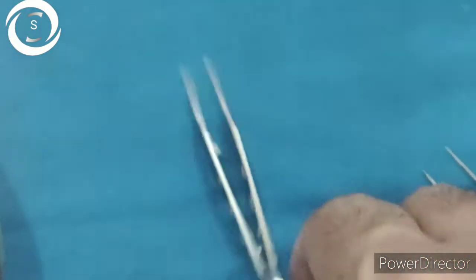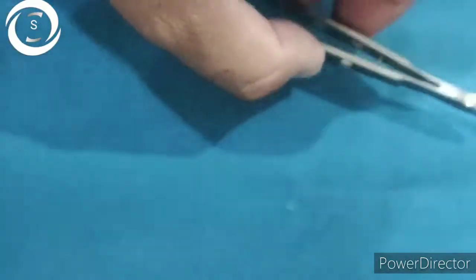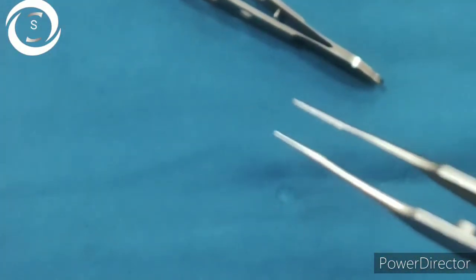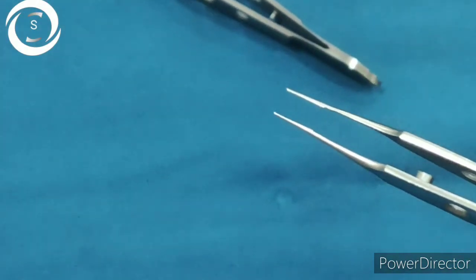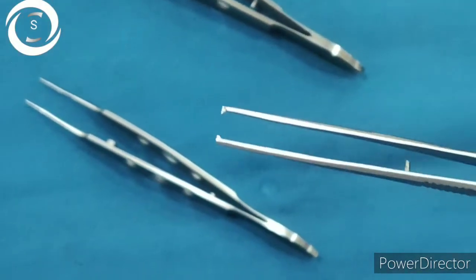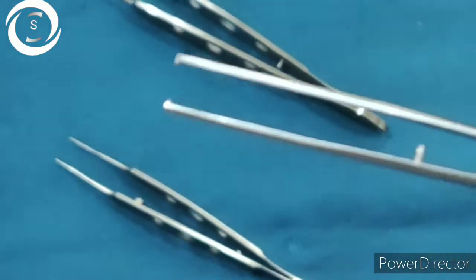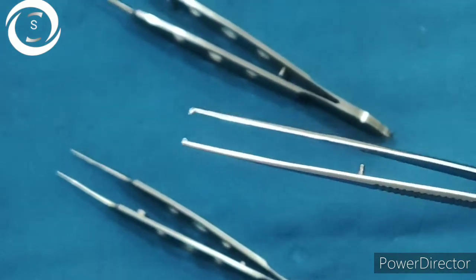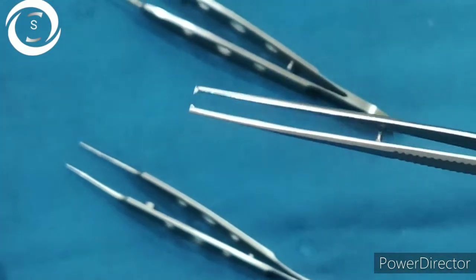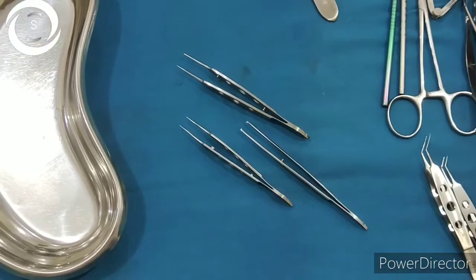Here you can see two similar instruments — a plane forcep called a suture tyer, and one with a small tooth called the corneal forcep. The suture tyer is used for suturing especially corneal wounds, and the corneal forcep is used to hold the cornea during suturing. The fixation forcep, or large tooth forcep, is used to hold the lids, skin, and wound in DCR — you can see the large teeth on this one.